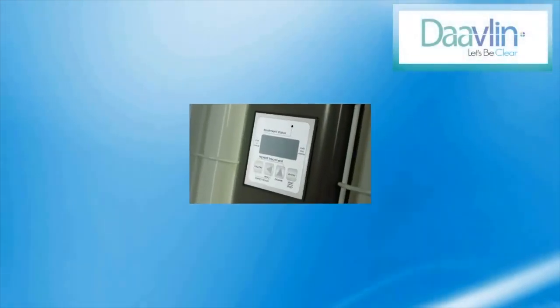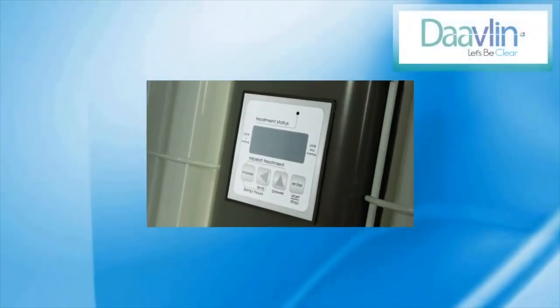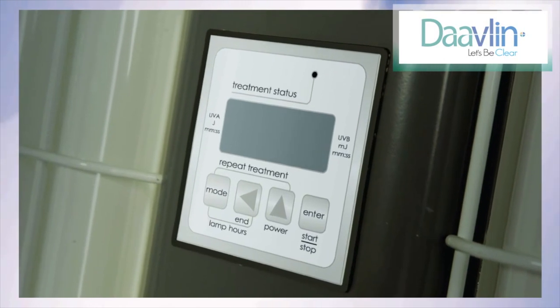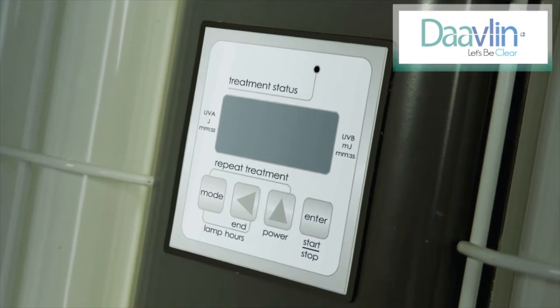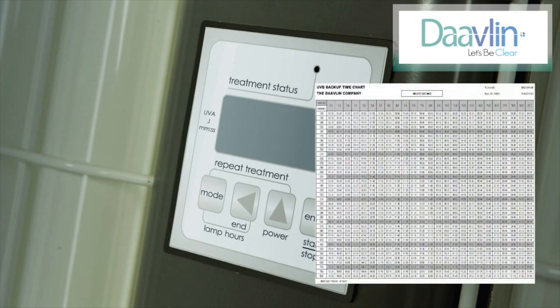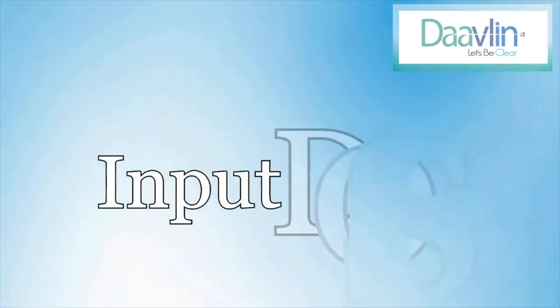Welcome to our instructional video on how to program and run your phototherapy unit equipped with integrated dosimetry. Before we begin, you will need the calibration output certificate along with the UVA or UVB backup time chart that came with your unit. When programming a treatment, you will need to input the dose you want to receive as well as the proper safety backup time.